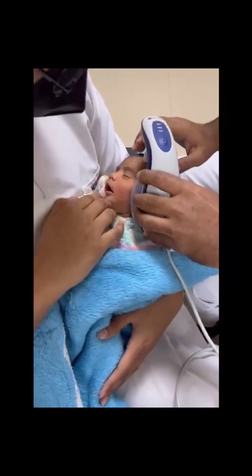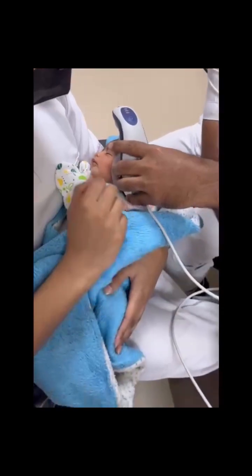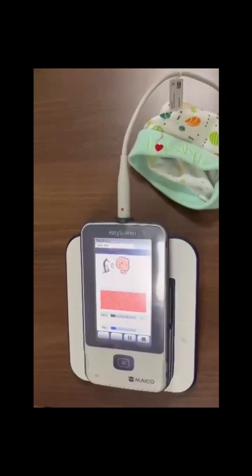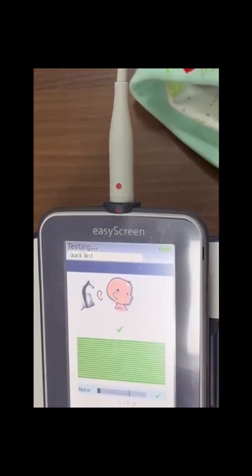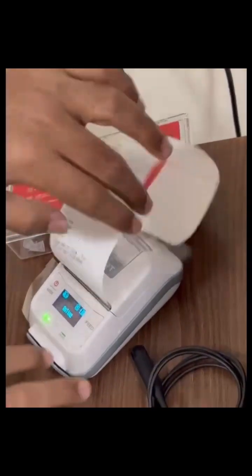A quiet room is best for hearing screening. Then record the readings. Once the test is completed, it will show the green colored lines as you can see. Finally, you can take the printouts of the test.